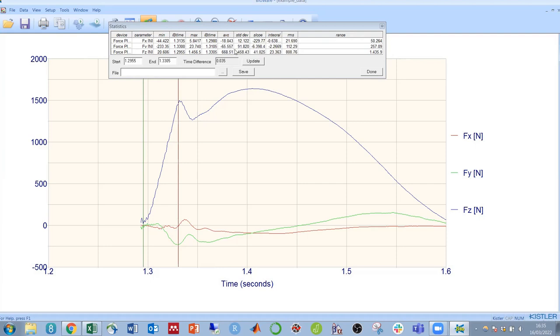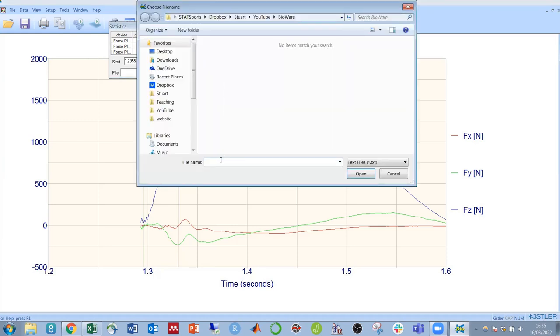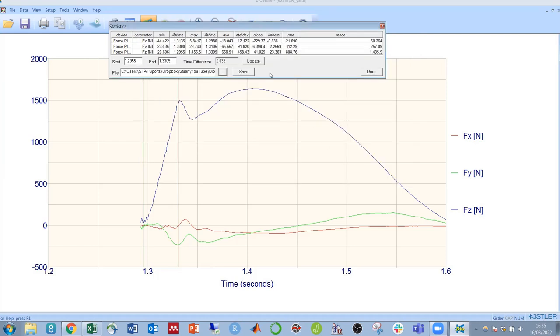Once you've got the values that you need, it's possible to save this box of values by clicking in here, typing in a file name. So let's call that results, and we can then save it. That can then be opened in Excel.